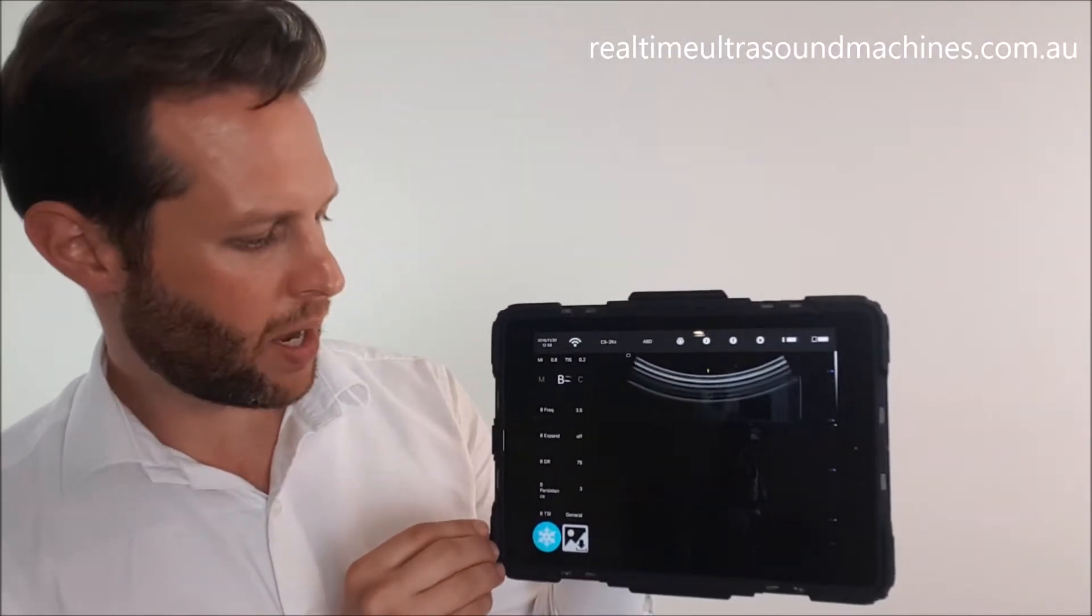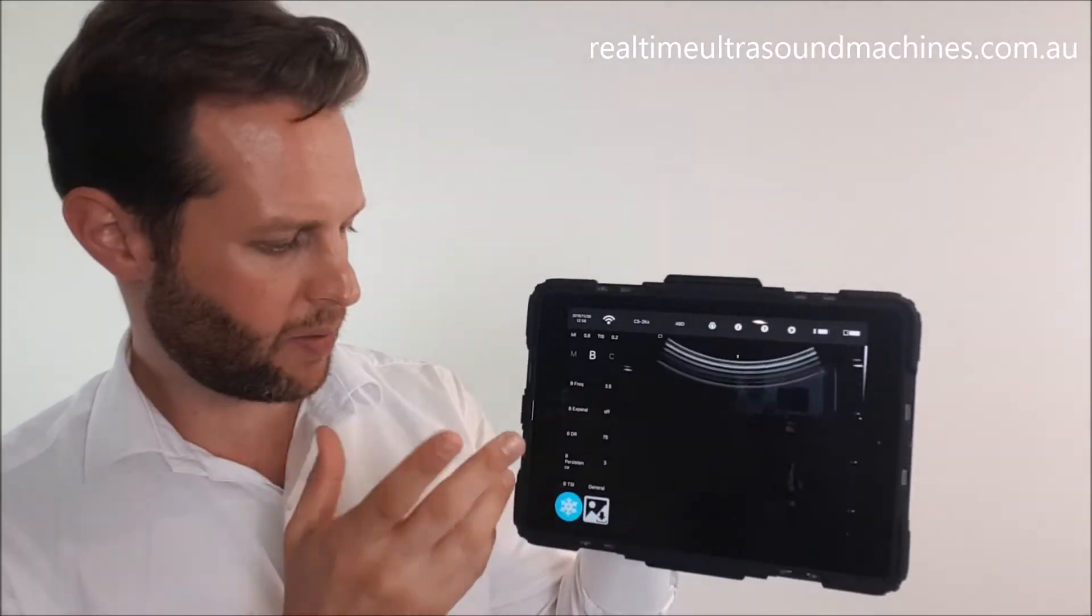To get back to normal B-mode imaging, just slide the slider back across to B. Now if you've got an image you want to save or measure, all you have to do to save the image is hit this little button here and it'll save it to the camera roll.